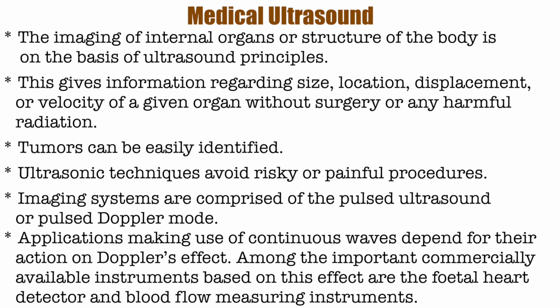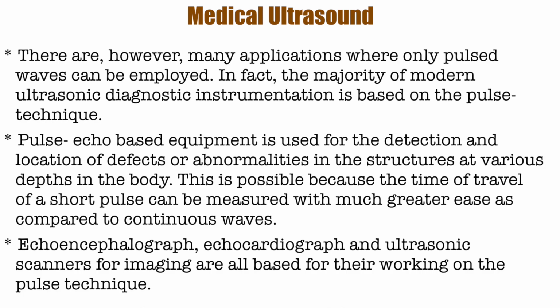Imaging systems are comprised of the pulsed ultrasound or pulsed Doppler mode. Applications making use of continuous waves depend for their action on the Doppler effect. Among the important commercially available instruments based on this effect are the fetal heart detector and blood flow measuring instruments. There are, however, many applications where only pulse waves can be employed. In fact, the majority of modern ultrasonic diagnostic instrumentation is based on the pulse technique.